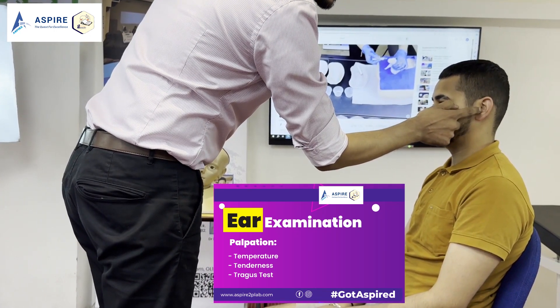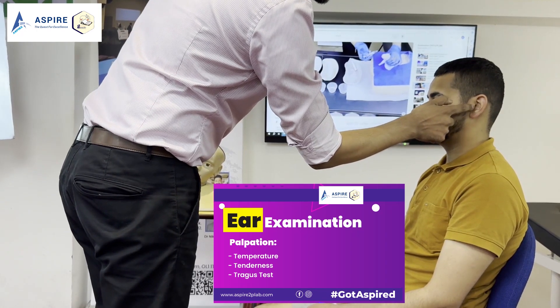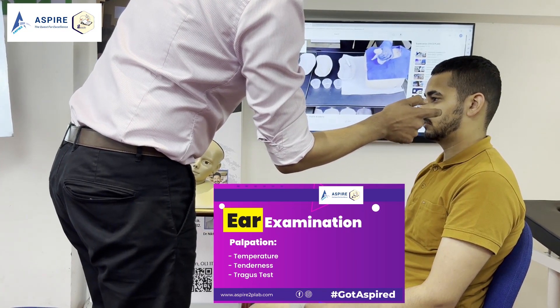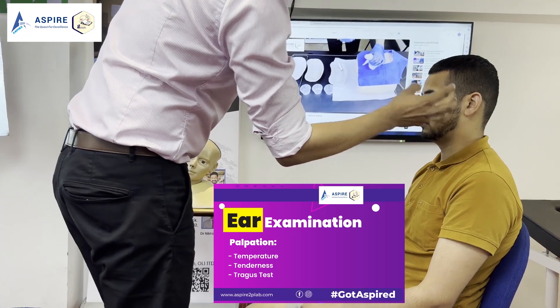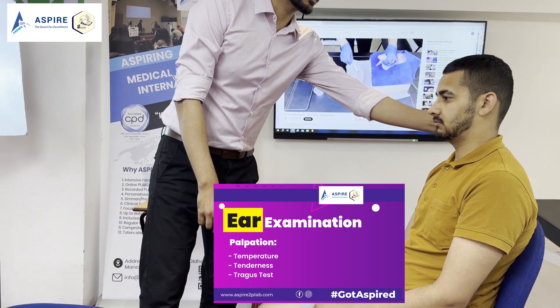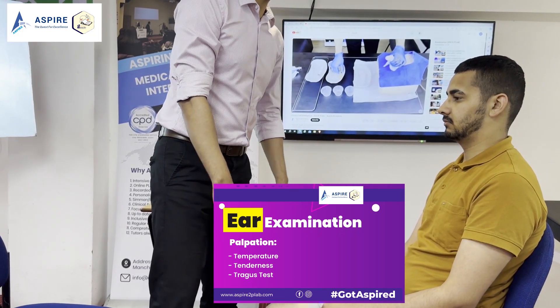Then we have to check for the tragus. This is very important. This is your tragus. You have to press on it to see if there is any tragus tenderness. If there is tragus tenderness, it means the patient might be having otitis externa and you may not be able to do otoscopy. Make sure you repeat everything on the other ear as well — pre-auricular, auricular, post-auricular, and tragus tenderness.